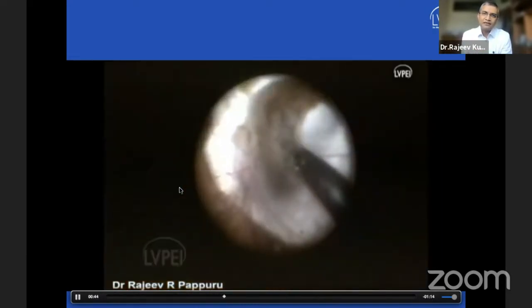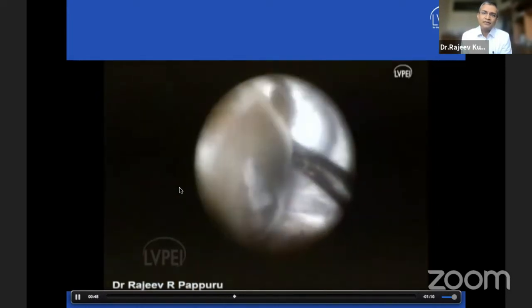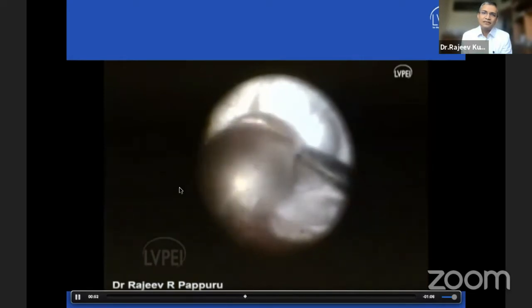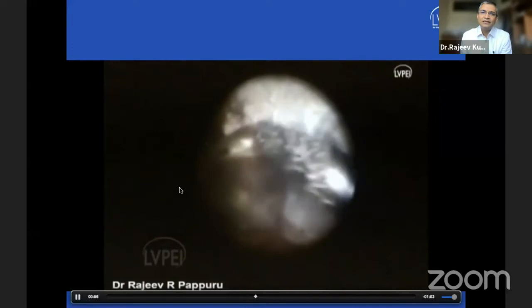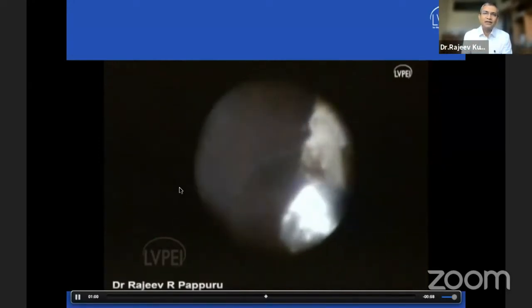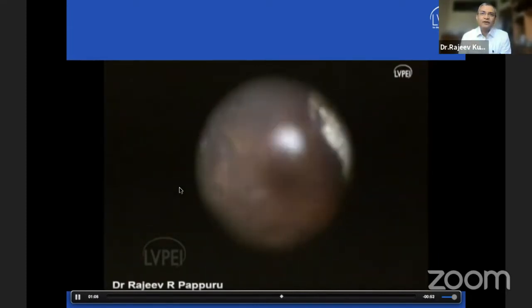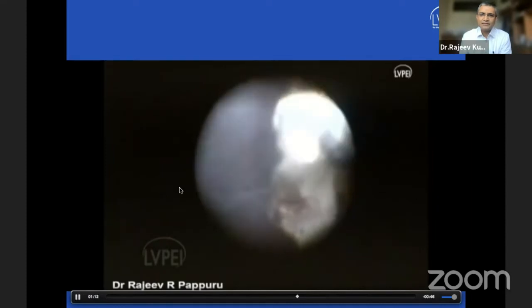So that's when I took out my endoscope and started using it to look at these areas and see the periphery. This is how the visualization with an endoscope would be for this. You have all the freedom to move your instruments wherever you want, and you can see the periphery well without any difficulty. So that's an advantage of using alternative visualization techniques in these types of cases.